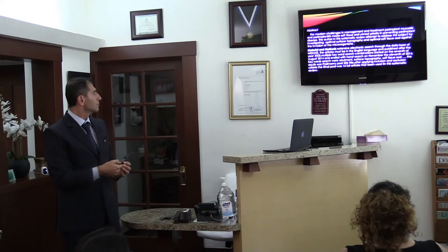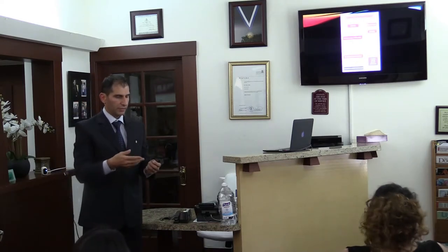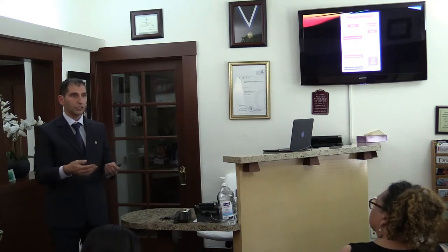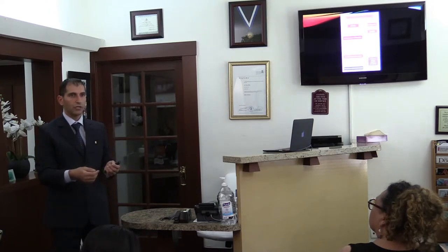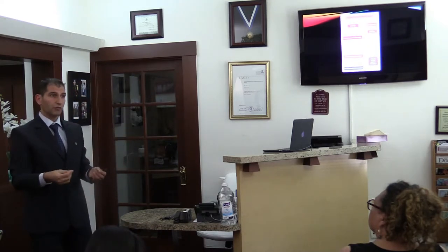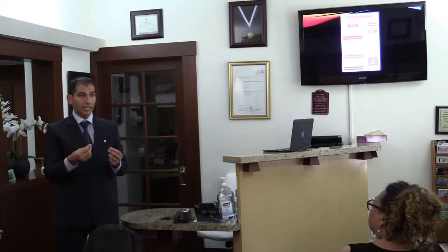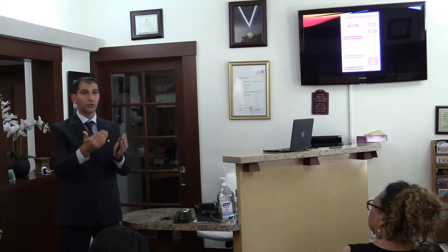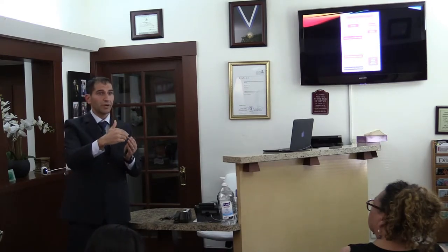My goal was, and my mentors speak German, and they have a different culture in Germany. The good thing was the Master of Science was in English, but when I told them this, they said no, you cannot write about this. In the end, they accepted it. What I told them to convince them was, I want a surface on my abutment that gives a good seal between the tissue, the gum, and the titanium or zirconium abutment or the material of your choice, so bacteria does not invade and cause peri-implantitis.